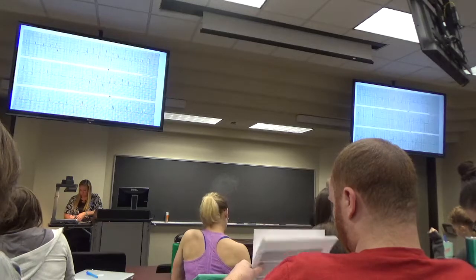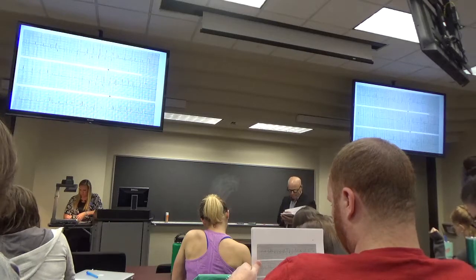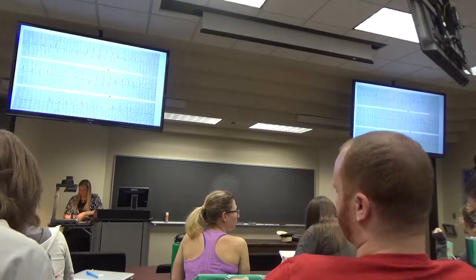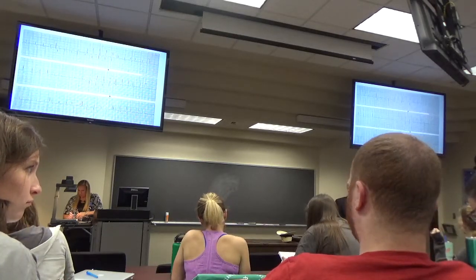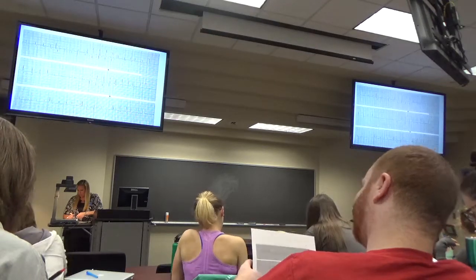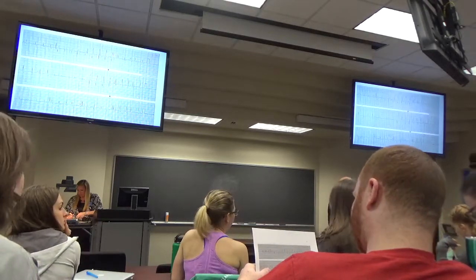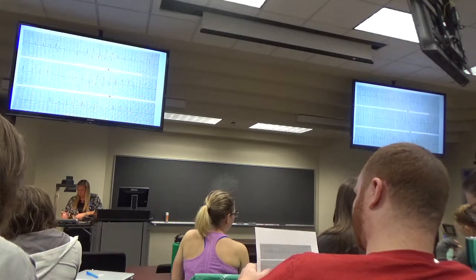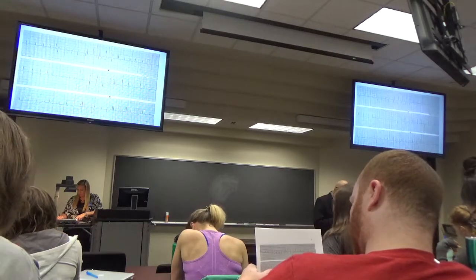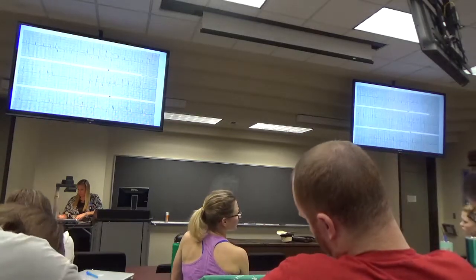Anything else? What is your QRS interval? I got 0.12. And there's absent initial R waves in V1. So what does that mean? I don't know either. Yes, there are initial Q waves in V1, 2, and 3. Your note says to explain the absence of initial R waves in V1. That's the infarct. Q waves are an infarct. Okay, I just overlooked that.